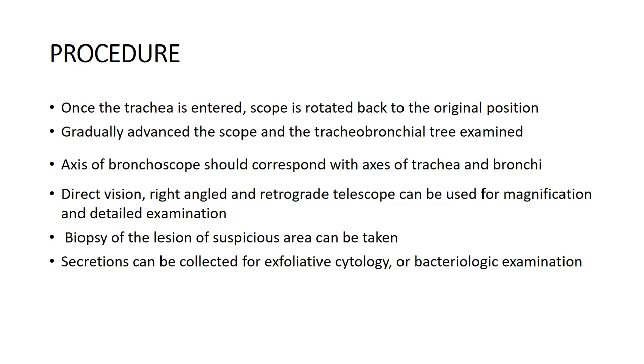The axis of the bronchoscope should correspond with the axis of the trachea and bronchi. Direct vision, right angle, and retrograde telescopes can be used for magnification and detailed examination. Biopsy of the lesion can be performed in the case of a suspicious area, and secretions can be collected for cytological and bacteriological examinations.